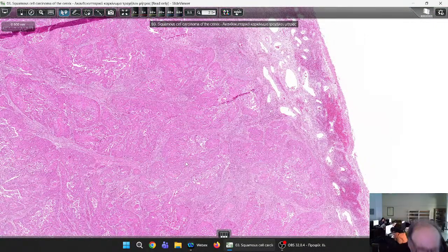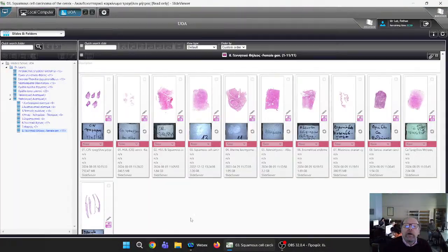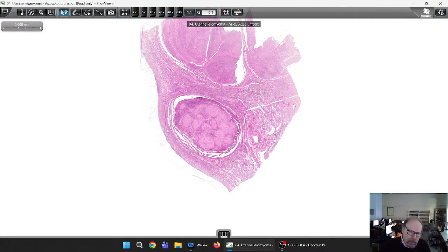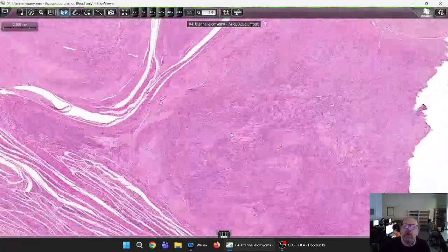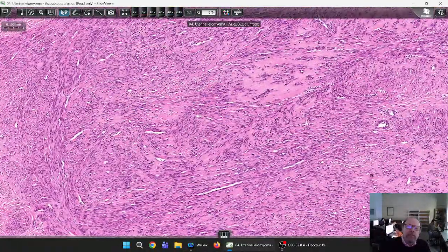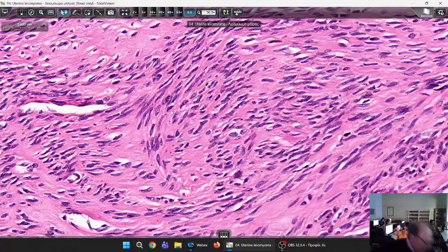So, now we have the uterus, and we can see in the uterus wall these nodules, which are composed of cells forming interlacing bundles. You see? Have a look at the nuclei in these bundles. The nuclei are spindle-shaped. So, spindle morphology in the nuclei is consistent with which origin of cells?